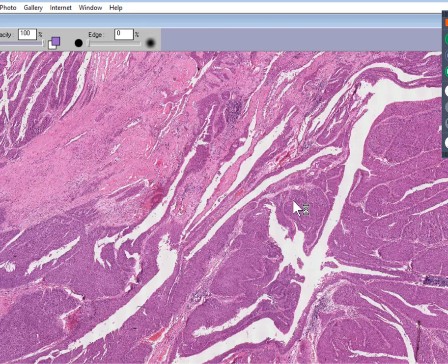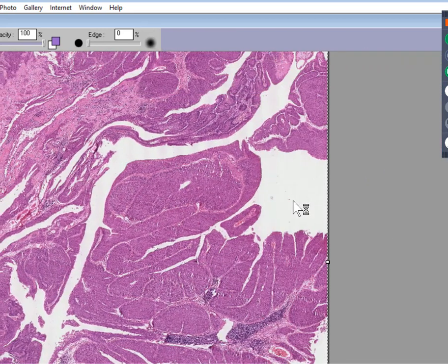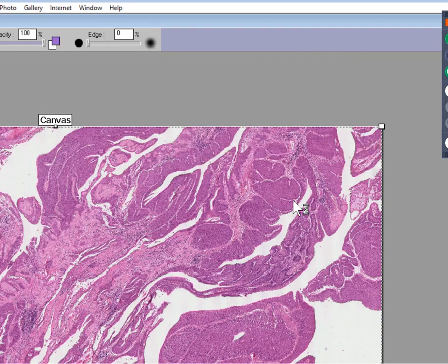In other words, the tumor cells are lining these fibrous structures here. So we would probably call this the papillary growth fashion. By a papillary growth fashion, it means it doesn't grow flat, but it grows on little finger-like projections. That's the best definition of a papillary tumor.